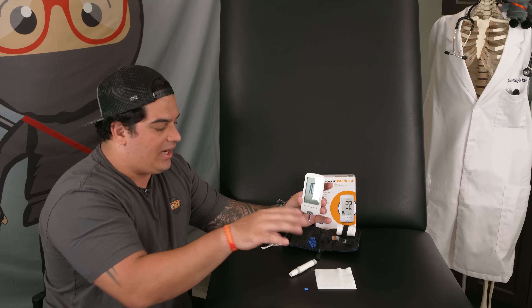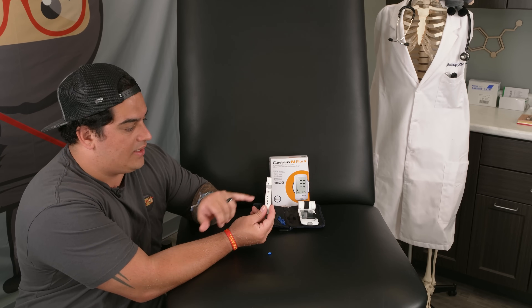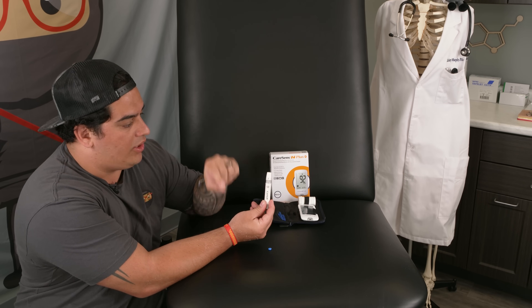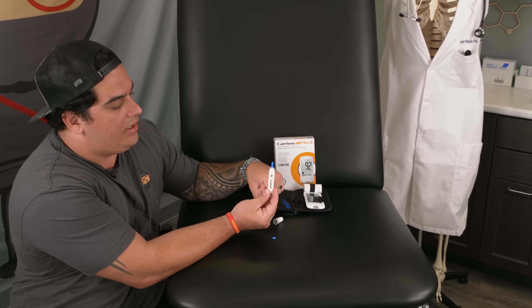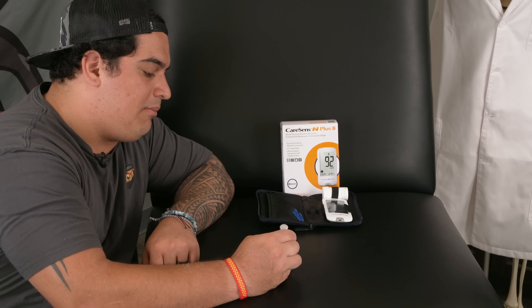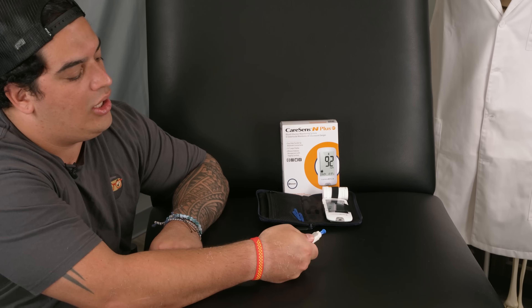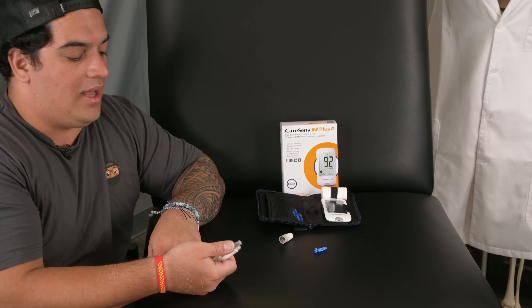Now I'm going to show you how to safely dispose of the lancet from the lancet device. Make sure the button is in the safe position since you've already delivered your skin prick — you don't want to accidentally stick yourself. Safely twist off the cap — you can see the needle is now exposed. Take that little blue top piece you kept nearby and cap the sharp end so it's no longer exposed. Then push on the gray portion to eject the lancet out of the device, and you can throw it away.